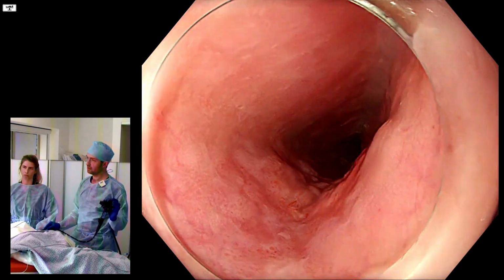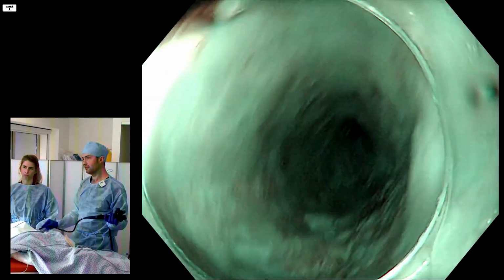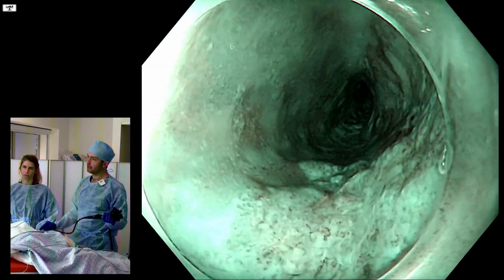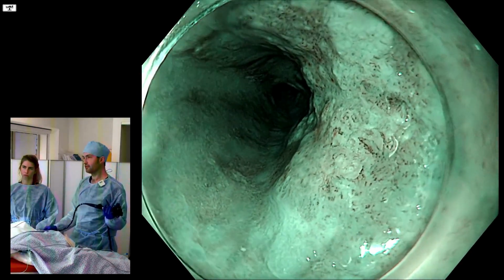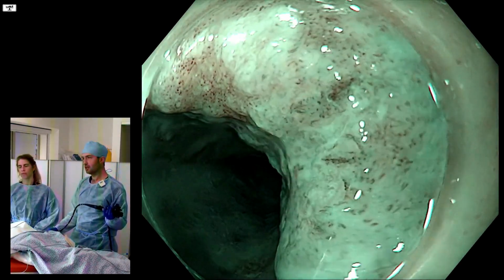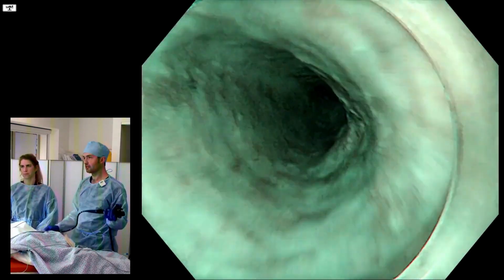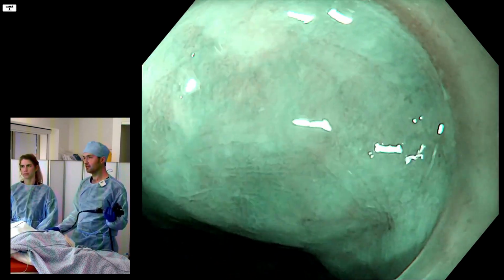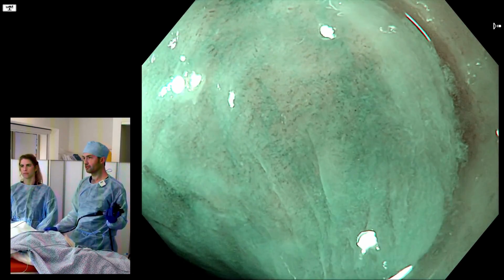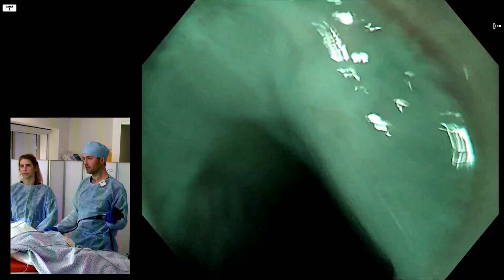So if you are taking our approach to the imaging of lesions found in the upper gastrointestinal tract, then you will know that our approach is to look at the underlying structure, and that you can do by using narrowband imaging, and think about whether the structure is regular. So I might show you a regular structure by coming up here and just looking at something like this, where you know, there's all sorts of little blood vessels there. You can see them here in the 12 o'clock. They're all regular. They're all pointing in the same direction.